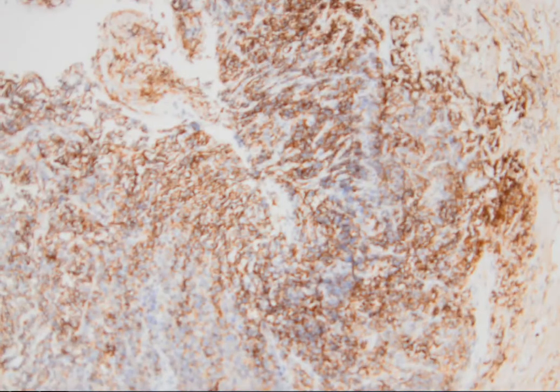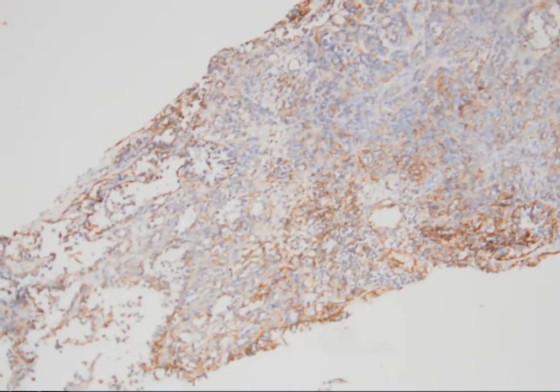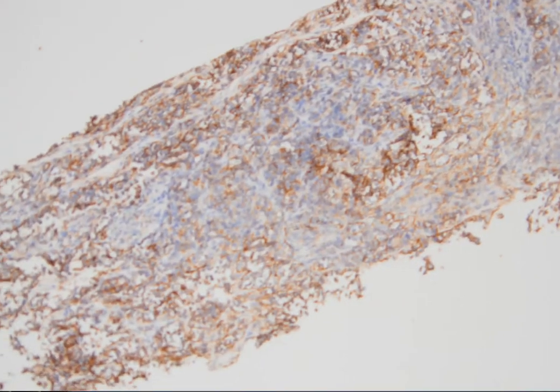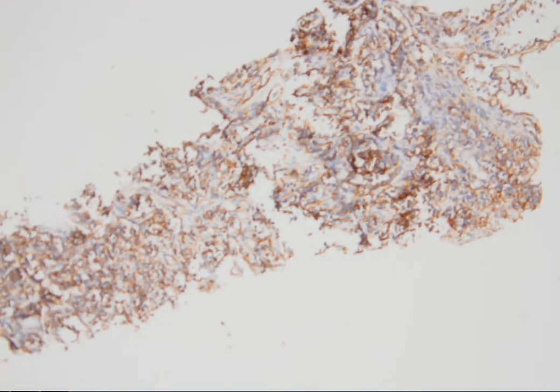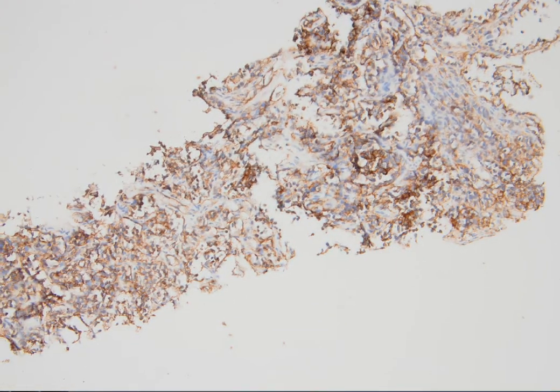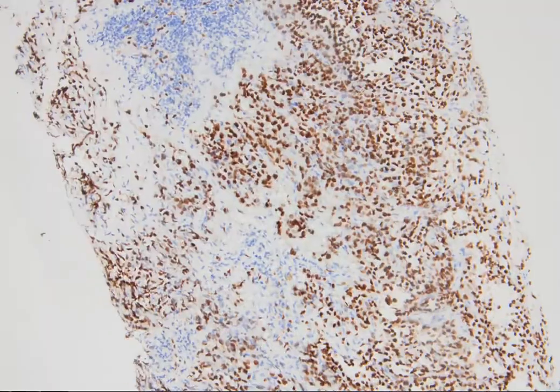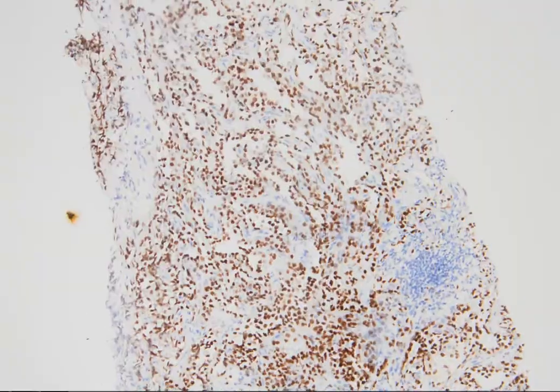It may also be expressed by some other tumors like plasmacytomas or histiocytic neoplasms, but ERG will cover these weaknesses. ERG is diffusely and strongly nuclear positive.